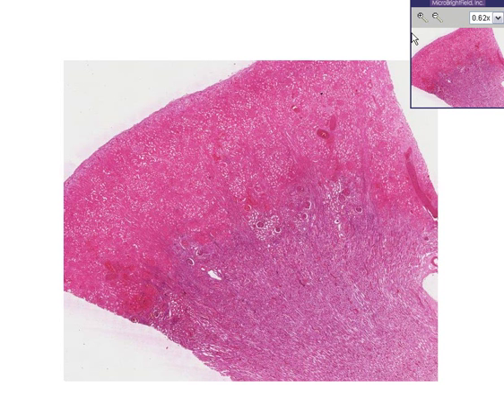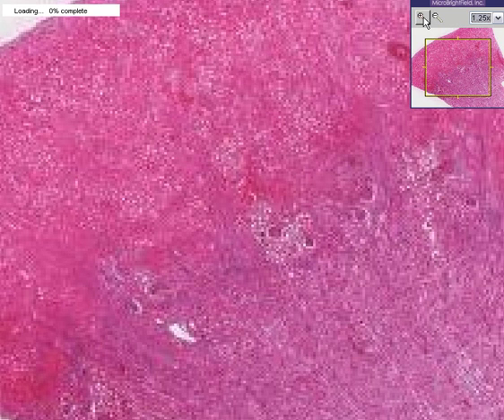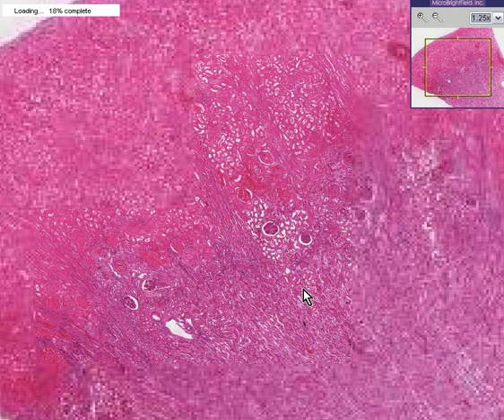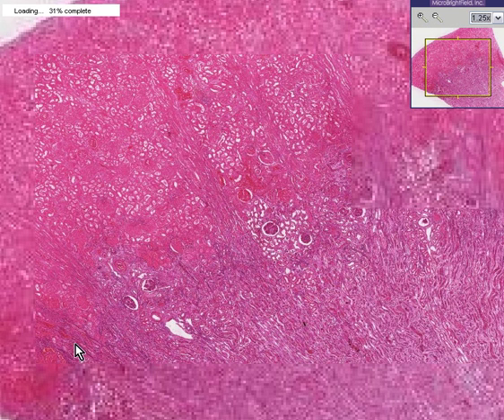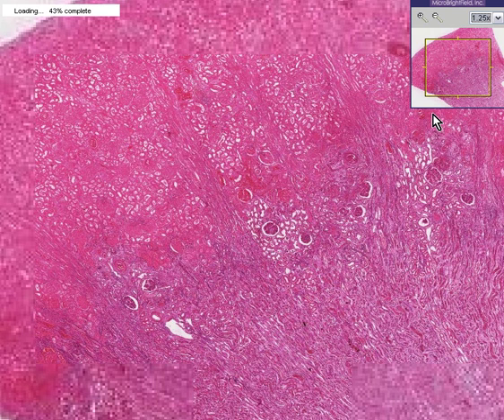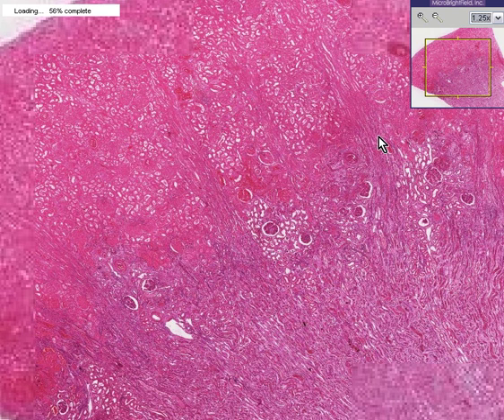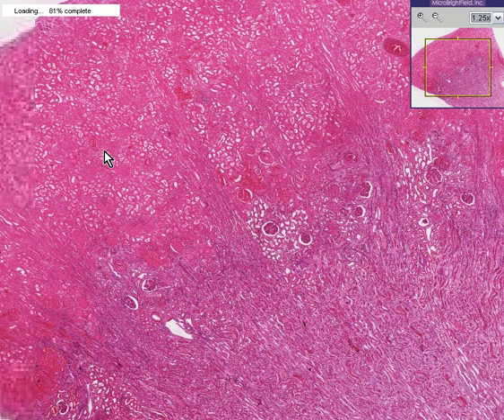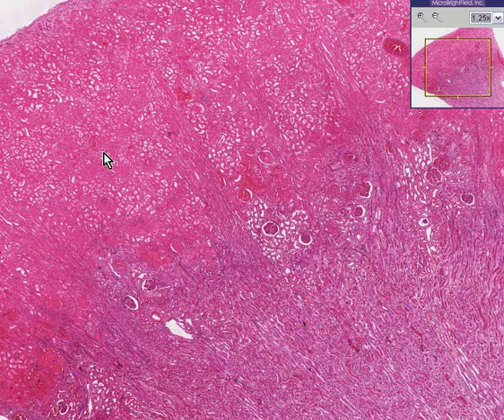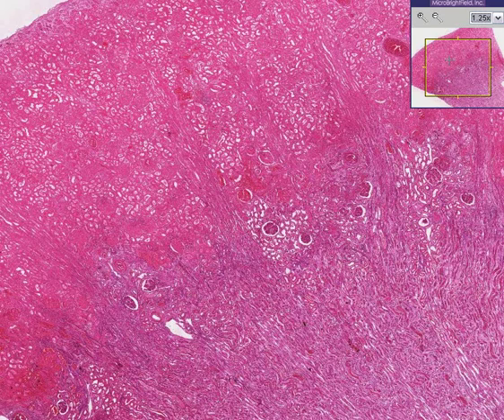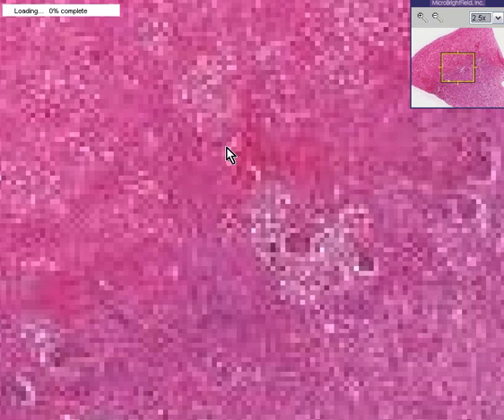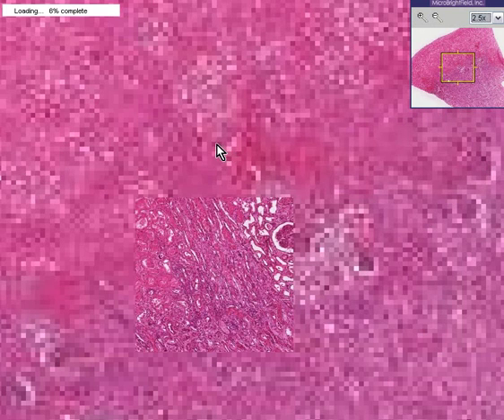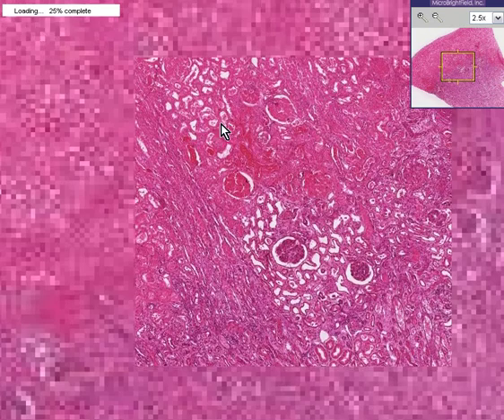Why is this happening? Let's zoom in a little bit. You could see once again the transition zone, and the redder tissue up here looks to be completely necrotic, in that when we go up to look at it we won't really see much by way of viable staining material anymore.